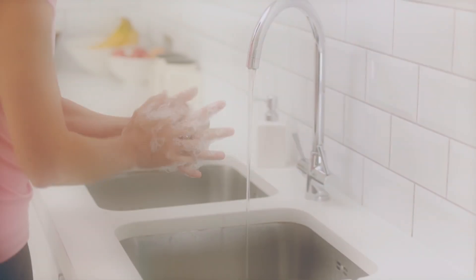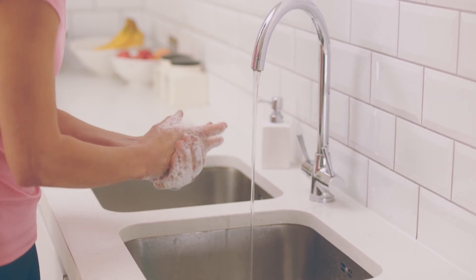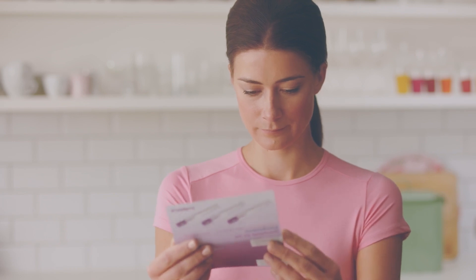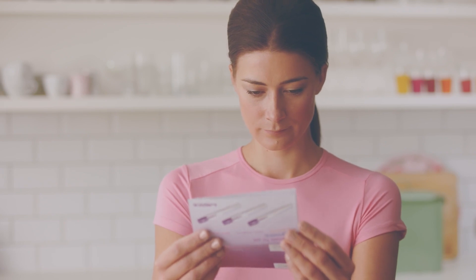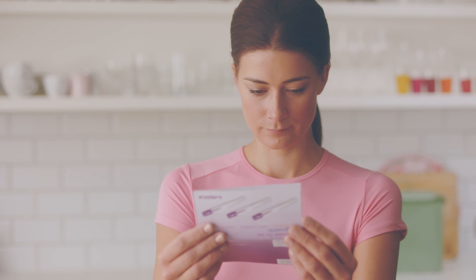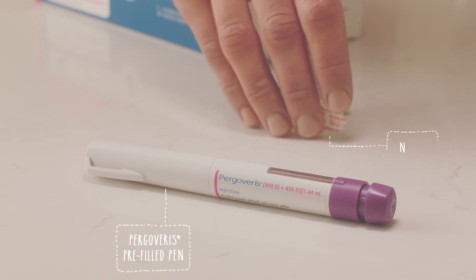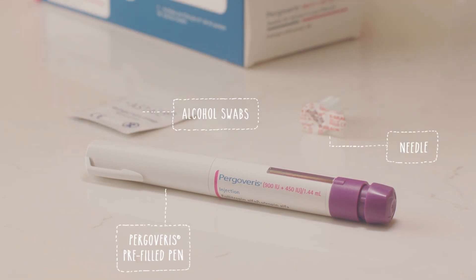Before you get started, make sure you've washed your hands properly with soap and water. As well as watching this video, make sure you read the leaflet that comes in the pack with your pen and speak to your doctor or nurse if you have any questions. You'll also need to make sure you have all the things you need for your injection: your correct strength Pergoveris pre-filled pen, a needle, alcohol swabs, and a sharps disposal bin. You will need to ask your doctor or nurse for alcohol swabs and a sharps bin.